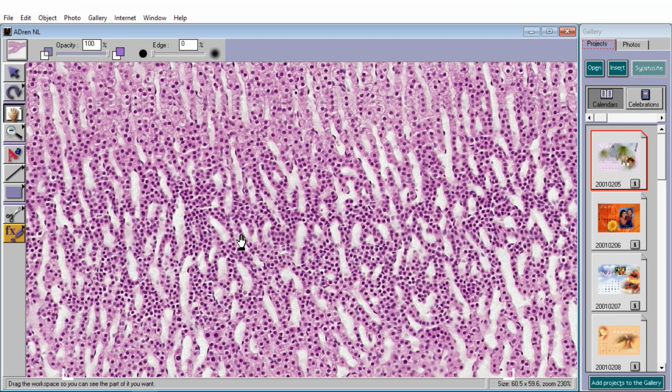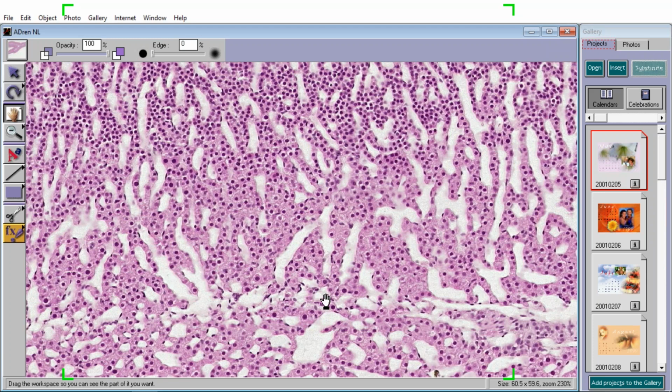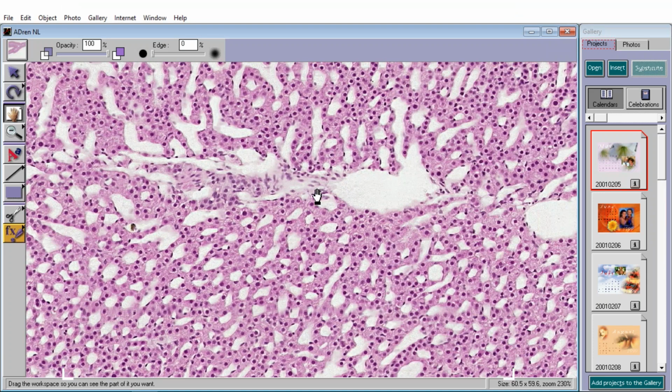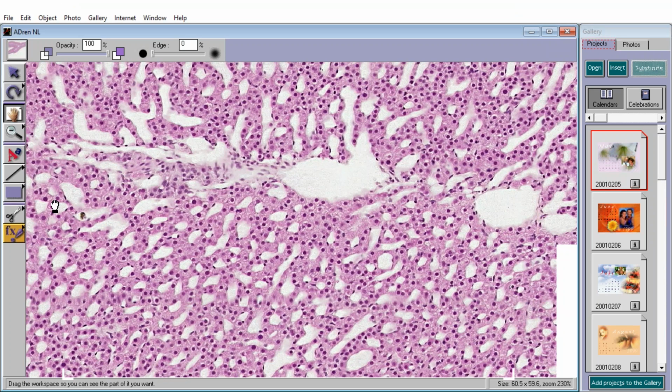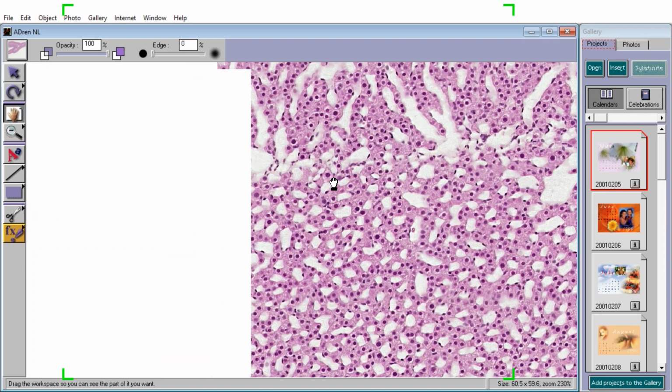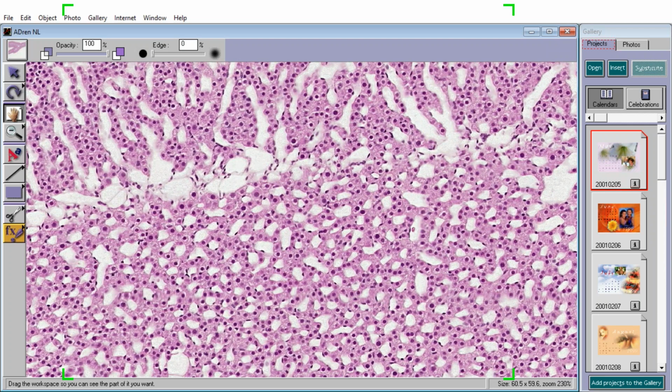And then you may remember that GFR for glomerulosa, fasciculata, and reticularis stands for GFR. You can also remember that it also stands for glomerular filtration rate, because right now you're basically resting on top of the kidney. Now, when you go further down, you then see cells that do not look like that, but they have very, very wide open vascular spaces. So, this is the adrenal medulla, where you need access to a lot of wide open spaces.